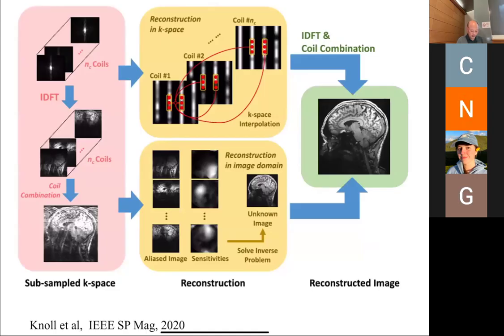So yeah, let's end here. Next time we'll pick up with compressed sensing. Today we mostly focused on this reconstruction of solving things in image space. In fact, what's done in your homework assignment is this solution, where we're solving that linear equation with the pseudo inverse.